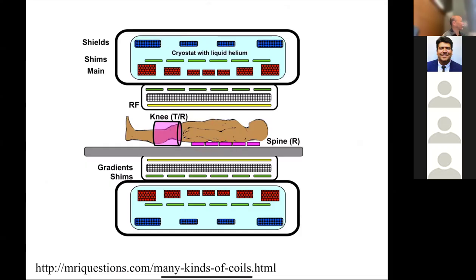Okay. So the job of the RF coil, if it's transmitting, is sending energy into the body. And if it's also receiving, it's listening to the energy that's coming out of the body. And that's how we're getting information in and out of the body. So you can have a coil that both transmits and receives. You could also have one coil do the transmit and another coil do the receive. We'll talk about both as we go through the course.